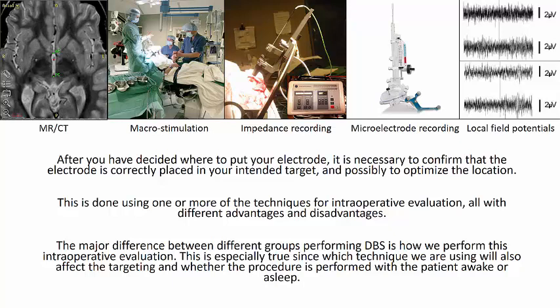The major difference between different groups performing DBS is how we perform this intraoperative evaluation. This is especially true since which technique we are using will also affect the targeting and whether the procedure is performed with the patient awake or asleep.